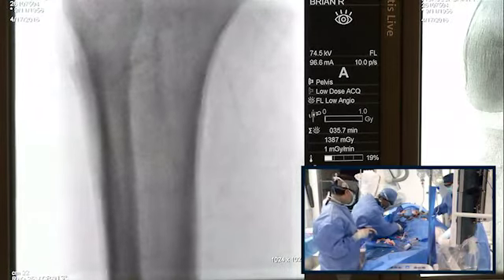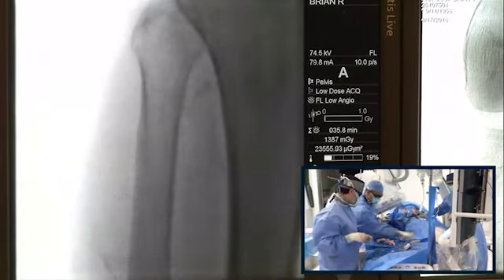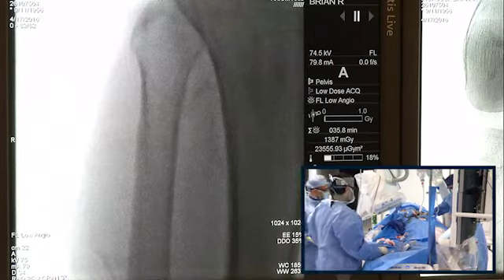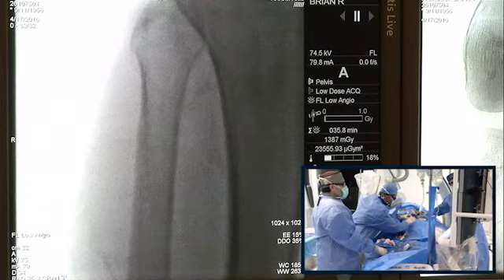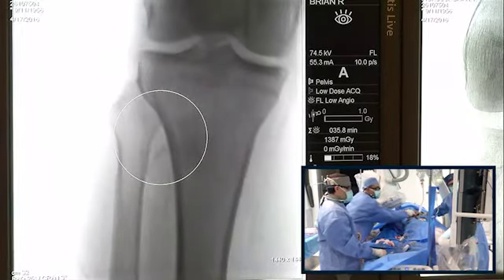Mr. Fiorucci, can you put your leg up with your toes up in the air? Yeah, there you go. Thank you very much. Can I have that syringe again? So one more picture here, just to give us a sense. Better to mag out a little bit.